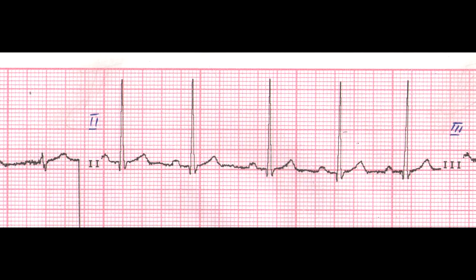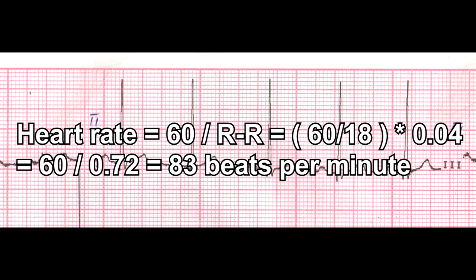The calculation of the heart rate for the patient's cardiogram is as follows: Heart rate = 60 ÷ (18 × 0.04) = 60 ÷ 0.72 = 83 beats per minute.